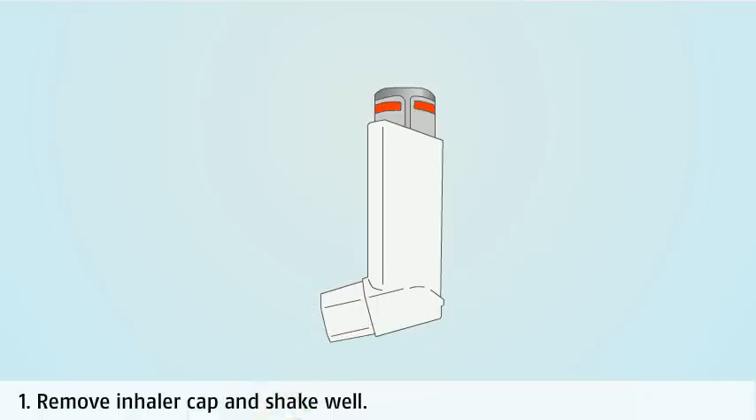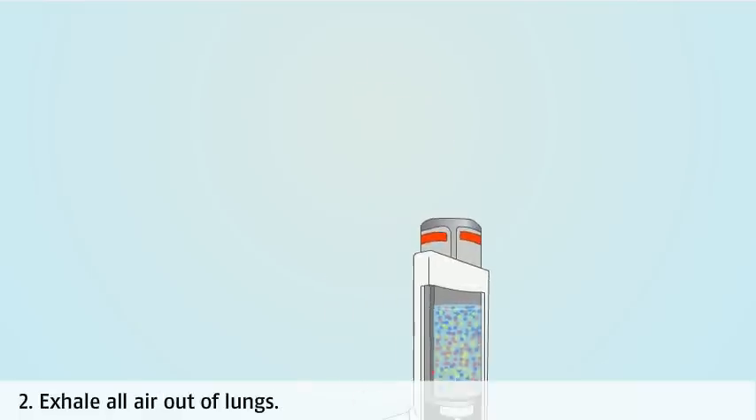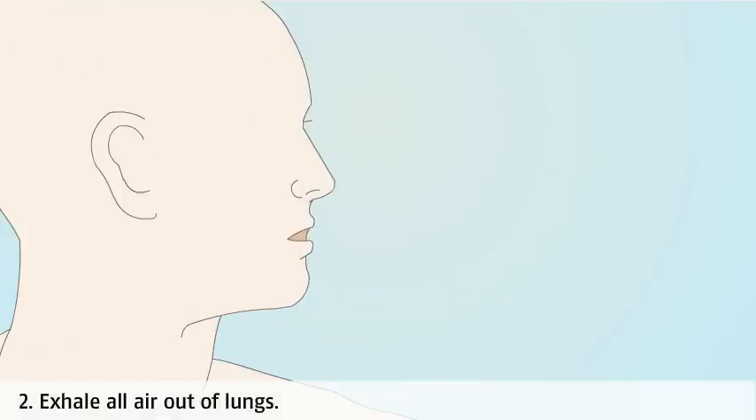Remove the cap of the inhaler before use and shake the contents well. Breathe out fully before the dose is inhaled, making sure you breathe away from the inhaler.